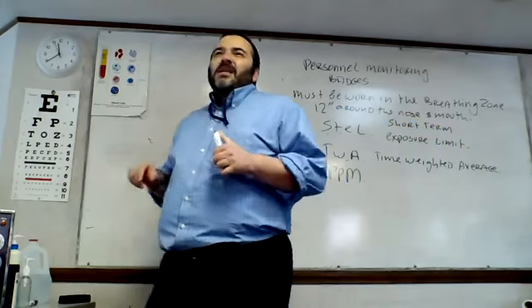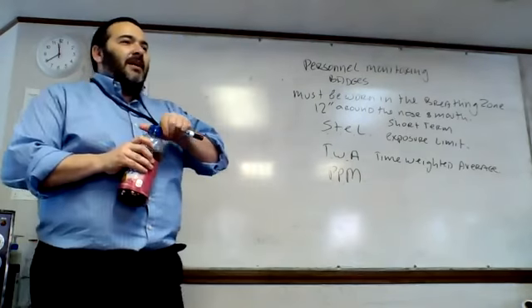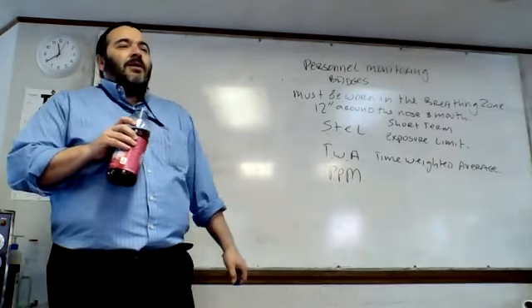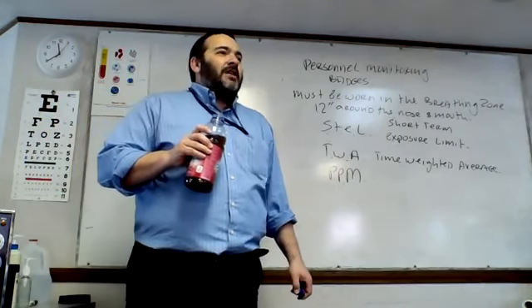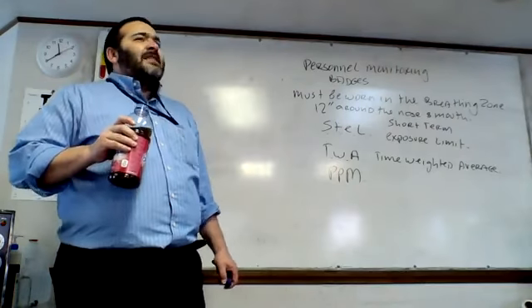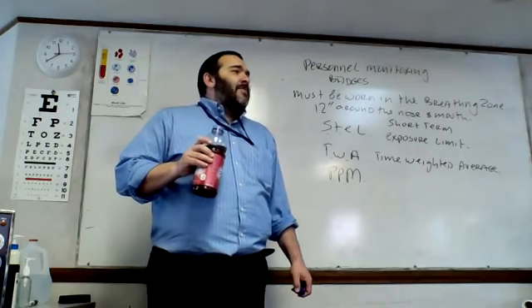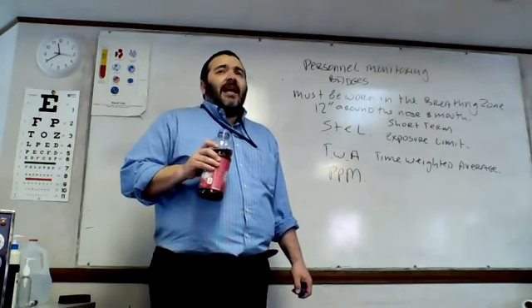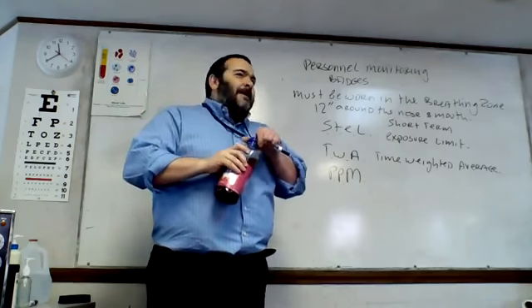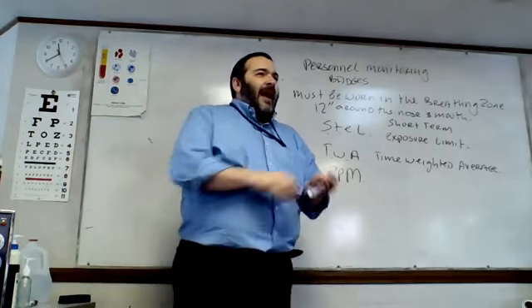What does that mean? That's when they take your total exposure to something, they divide it into 8 hours, and they show you how much you were exposed to over a period of 8 hours. That doesn't mean that continuously throughout the 8 hours you've been exposed. You may have been exposed once, inhaling some kind of a toxic fume. But they simply divide that into 8 hours because that's the average shift.